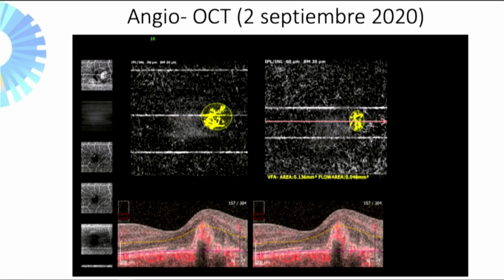pachychoroid neovasculopathy because of pachychoroid spectrum with this accumulation of fibrin, and we see the neovascular membrane. Since she is a patient with type A personality, she got injected. And in 2 weeks' time, she came to the office for me to see whether everything was all right.